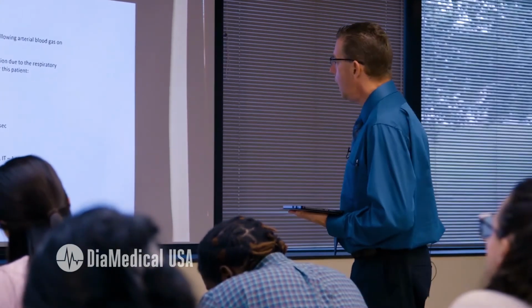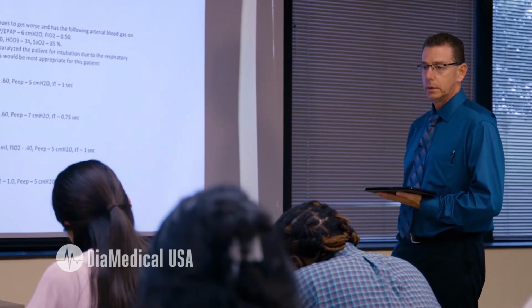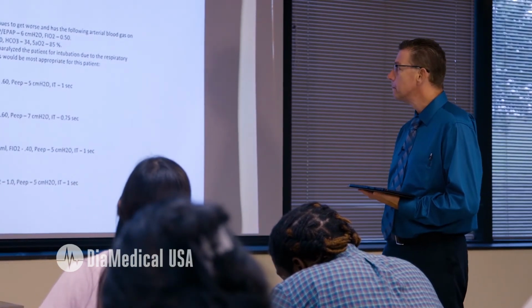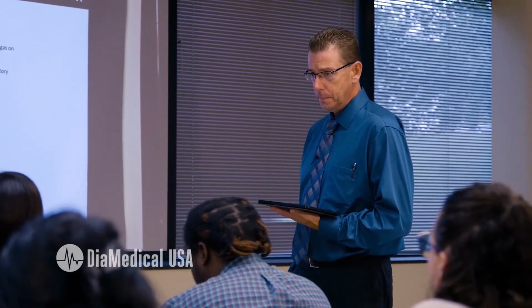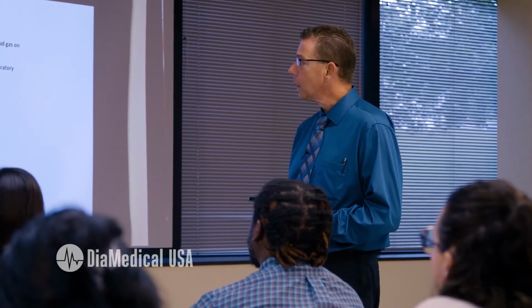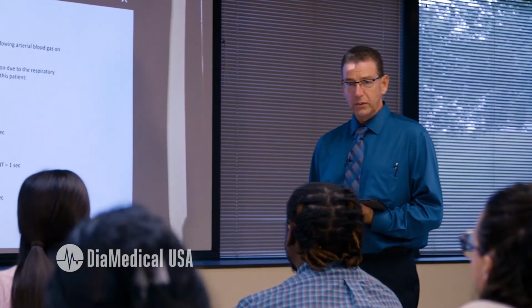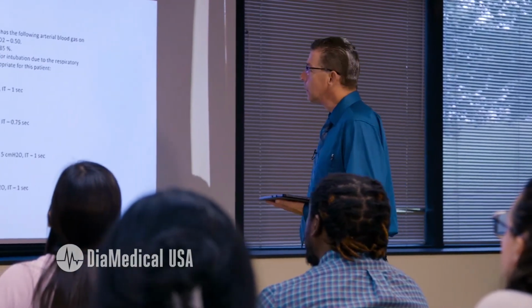Okay? Gabby, can you interpret that blood gas for me, please? Partially compensated respiratory acidosis with moderate hypoxemia. Okay. Now, did the patient get better on the BiPAP? No. Their CO2 and O2 did, and their saturations, but that's it. Okay. So, with that update, do you want to leave them on BiPAP or would you like some new choices? New choices.